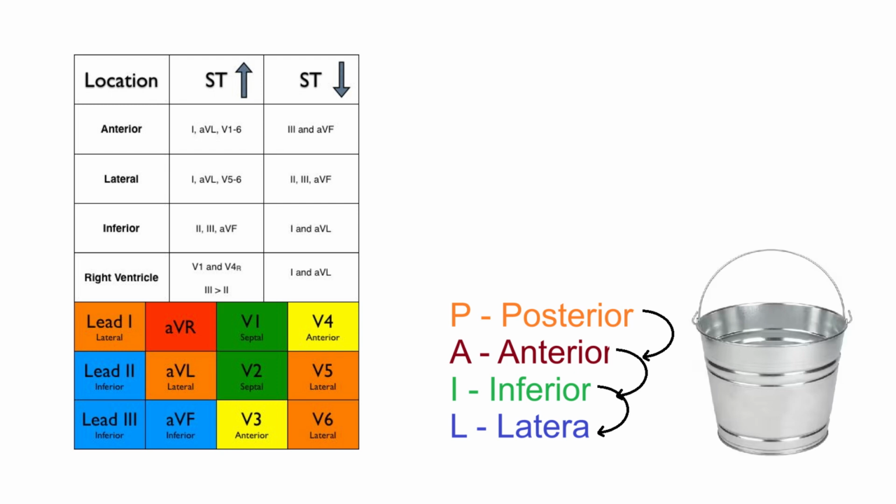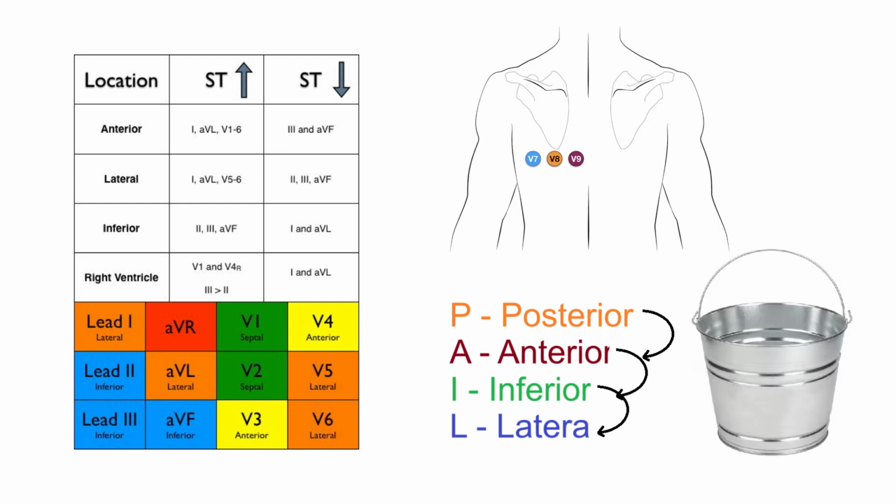The only way you see ST elevation is if you do a posterior EKG. And remember that anterior MIs give you inferior reciprocal changes, and inferior MIs give you lateral reciprocal changes. Also, don't forget to be a clever clinician. If your history and physical and your gestalt or your gut feeling says that there's something wrong, continue to dig, repeat EKGs, obtain some additional testing.